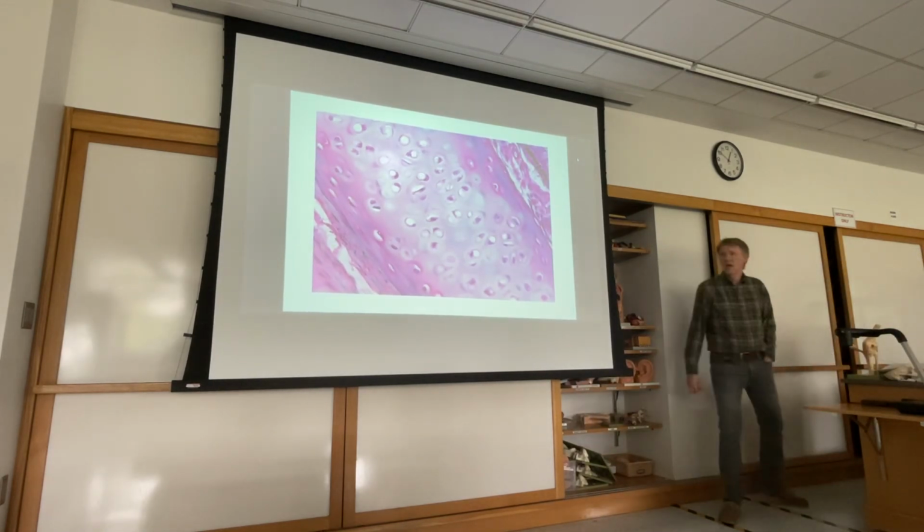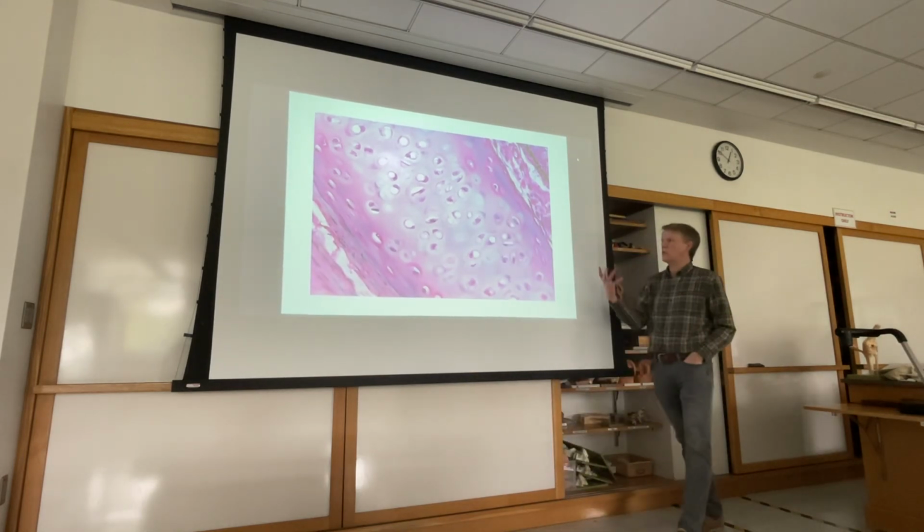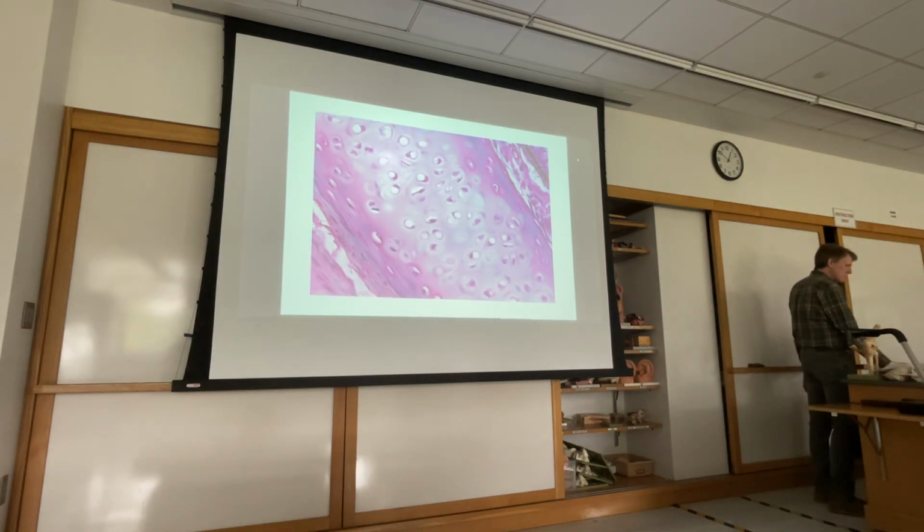Here's some more hyaline cartilage. Again, just that glass-like appearance to the extracellular matrix. That's the giveaway for that.